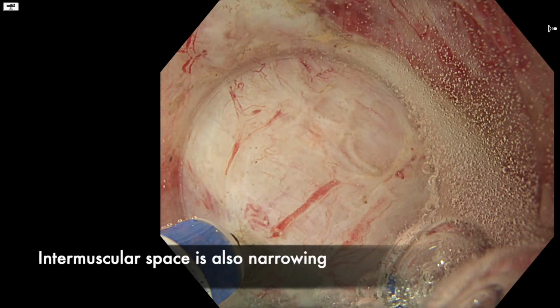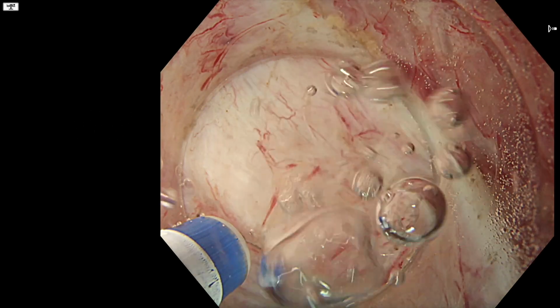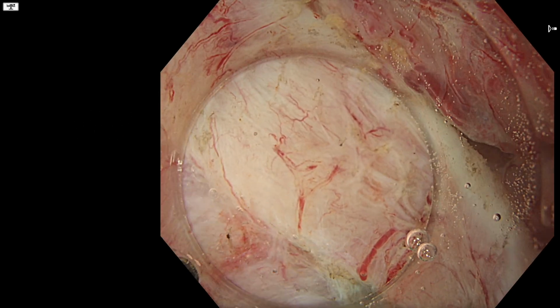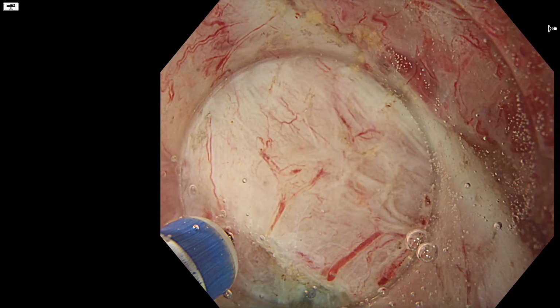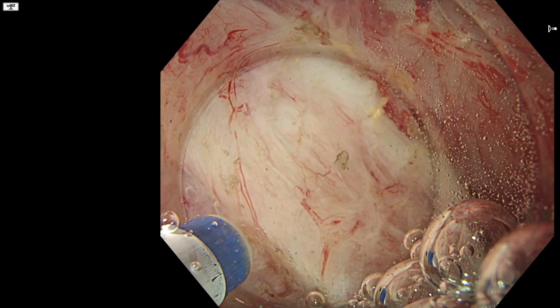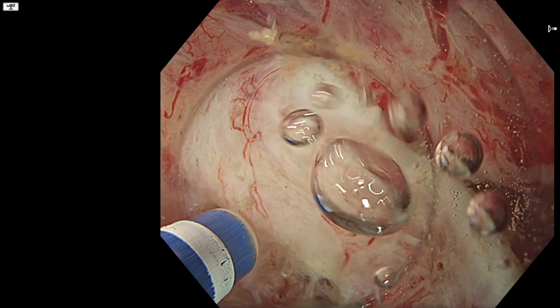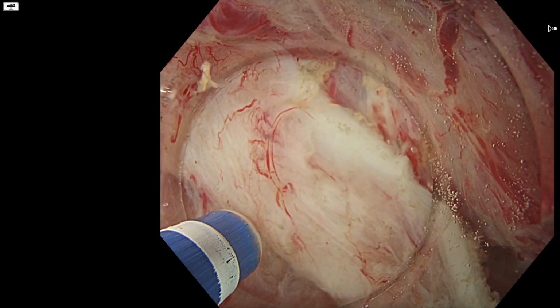As you can see, progress here is slowing down. The intermuscular plane is gradually narrowing, and as we advance under the lesion, the muscle fibers are becoming increasingly difficult to delineate. So we're starting to suspect that there may be some longitudinal fiber involvement here.